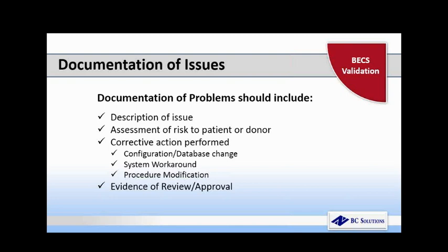Maybe you found issues within your configuration or database as you're doing the validation. Any issue or problem that you discover during validation should be documented. You need a description of the problem and what happened. It could be simply, what led up to this issue? How did this issue come about?